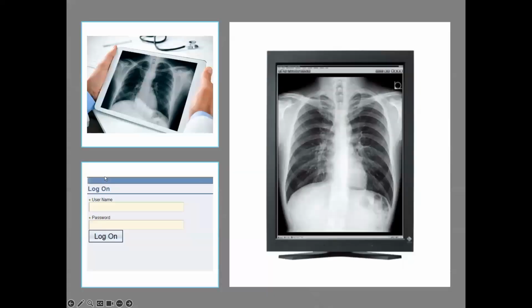So things are quite different than they were even just 20 years ago or so. Long gone are the days of old where you would evaluate an actual chest x-ray film, waiting for it to be developed, throwing it on the old light box. We're in a different era now, of course. The benefit of x-rays being electronic are there's quick processing, almost immediate feedback, right? More rapid and easier access, and we now have the ability to manipulate and enhance the original picture, whereas before it was not so easily accomplished.